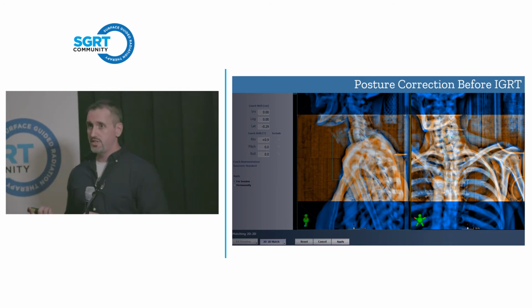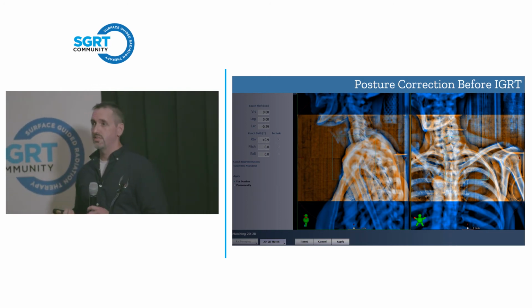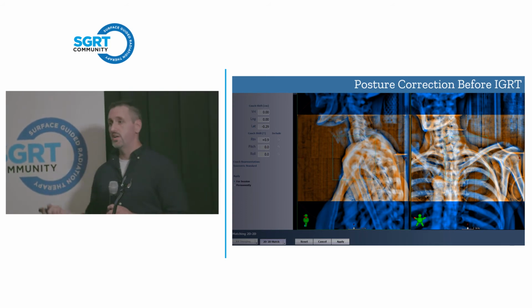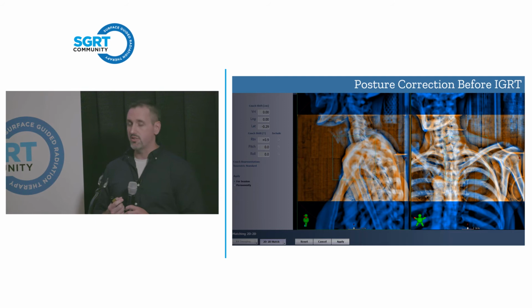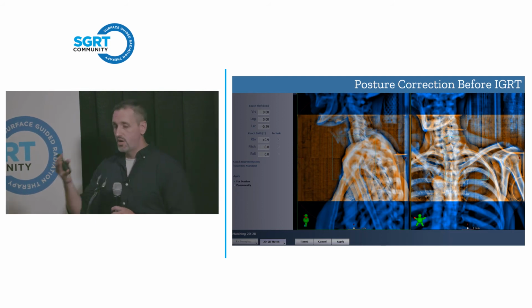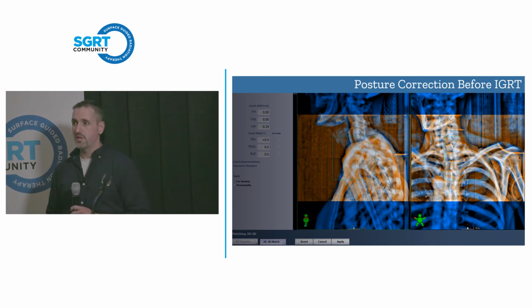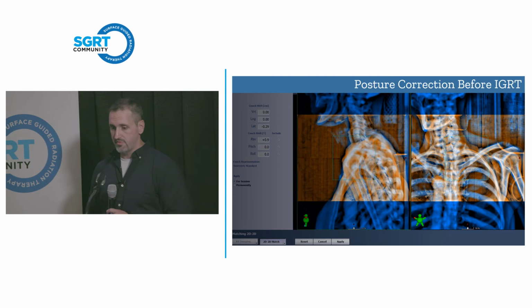We were able to treat this patient in about 10 to 15 minutes in a standard time slot without her being able to lay there. We could also check the immobilization after we created it, put her on the machine and said, okay, we're shooting for 15 minutes. We're gonna monitor you in this position to see if you can hold it. So we knew ahead of time what she could tolerate and whether or not the immobilization was gonna be adequate for the margins we were gonna use for these large VMAT fields.